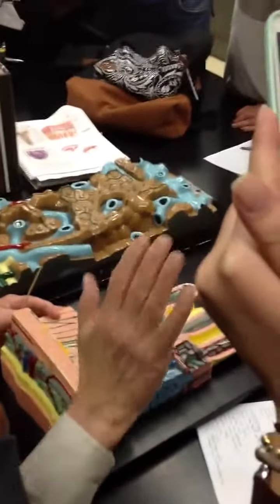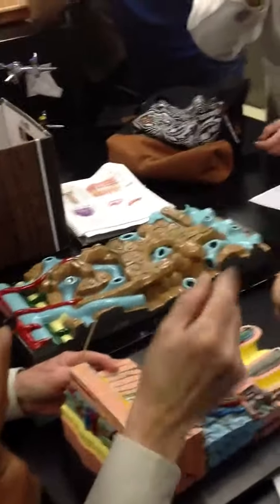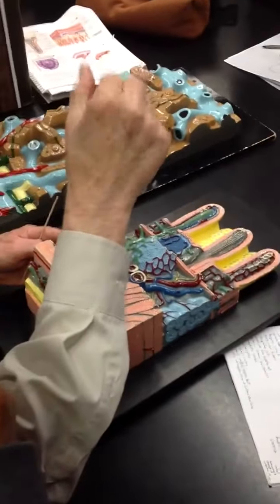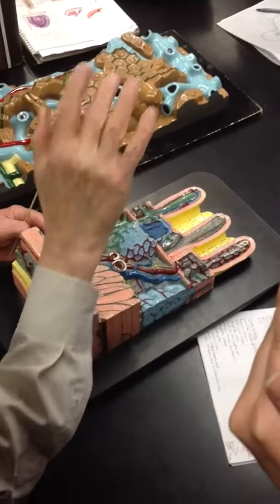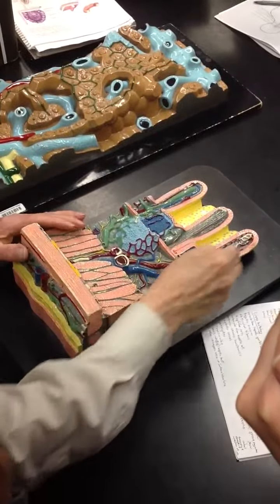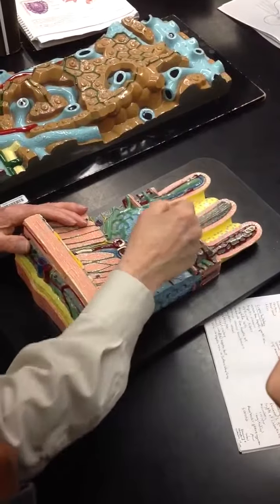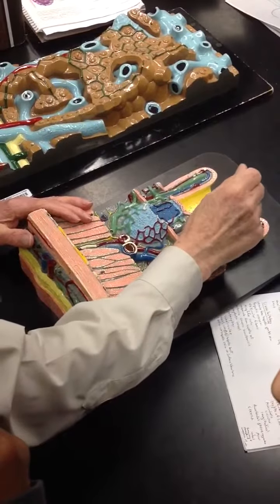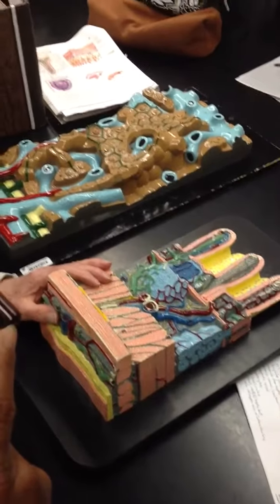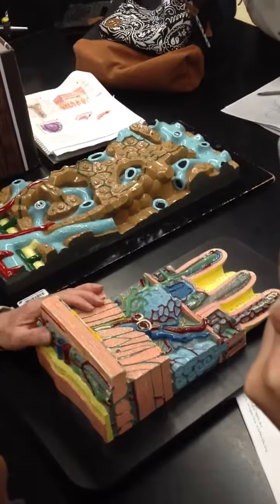Muscularis, and the surface has villi, and the villi are made up of not squamous epithelial cells, but of columnar cells with microvilli. So this represents a villus. Here's one villus, two villus, three villus. Here's another villus behind it. So these are villi. That's the first thing that you see on the list. Villi is plural. Villus is one.